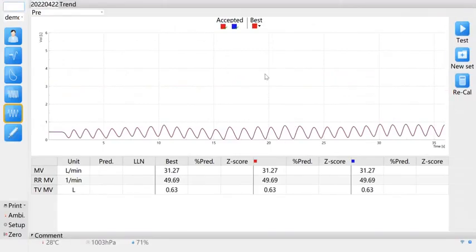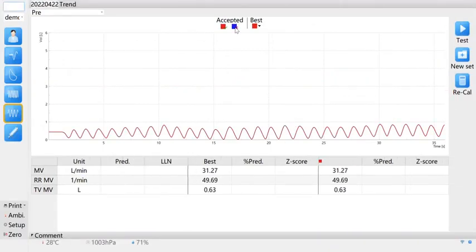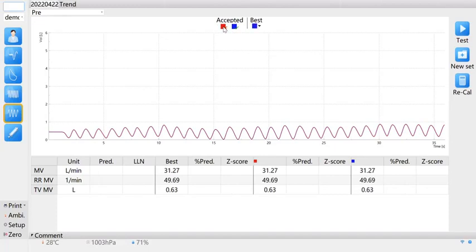Click the mouse to select whether to accept the test results. The test results are represented by different color curves. All tests are completed.